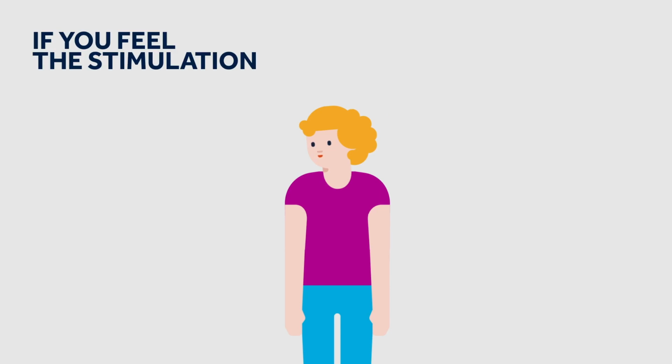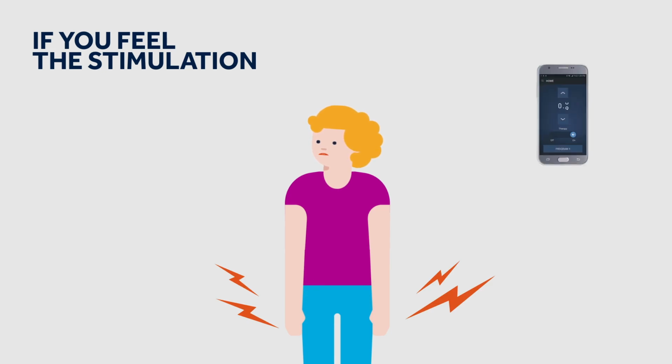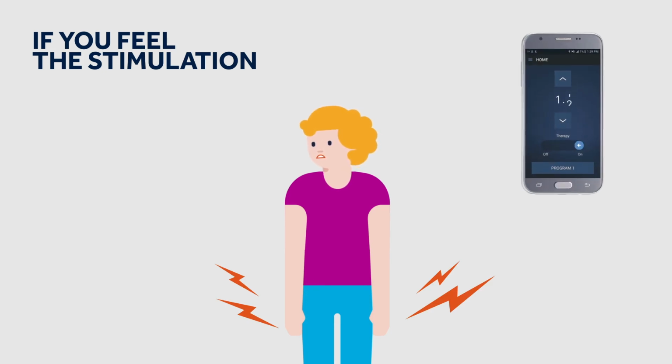However, there are also people who feel a little bit of stimulation on a day-to-day basis. But again, if the therapy is working for you, this is very normal. Turning the stimulation up continuously will not make it work better for you. It will likely become uncomfortable.